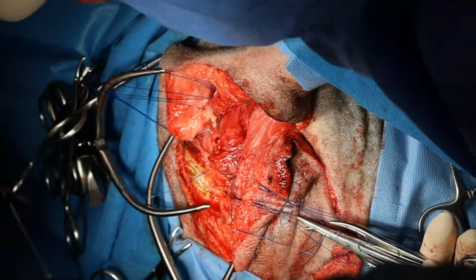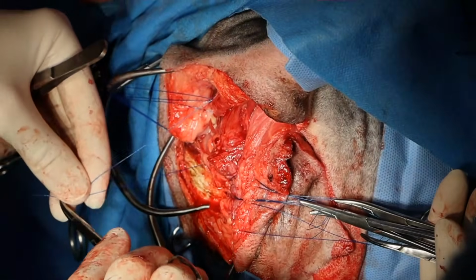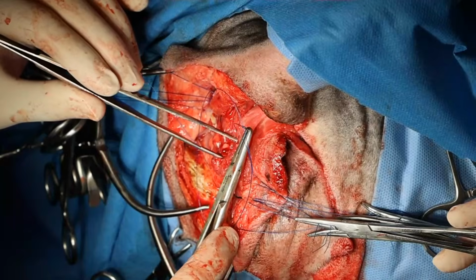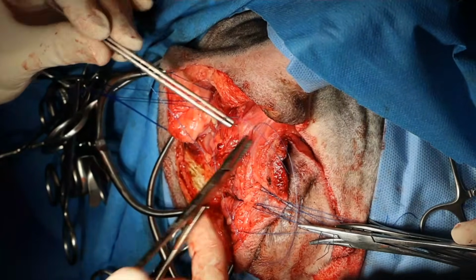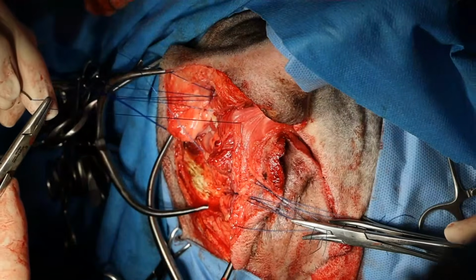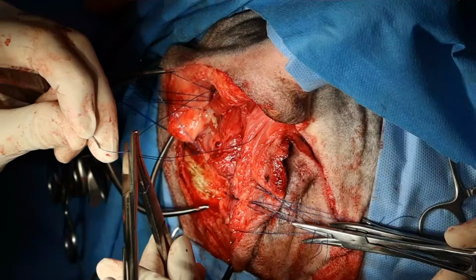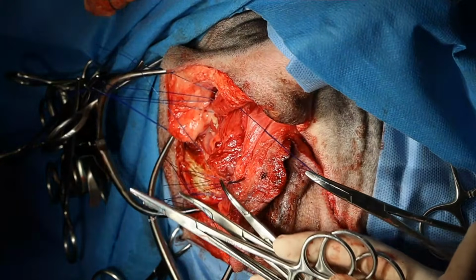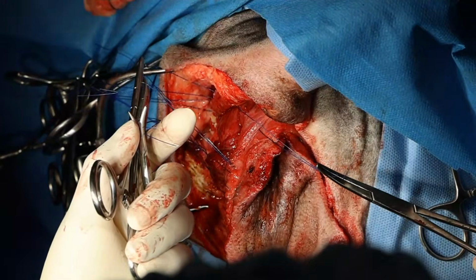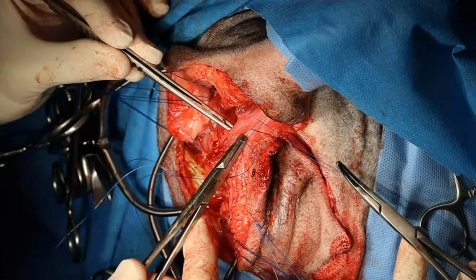And now I'll come across and do my levator ani. Sorry, internal obturator, no, guess again. Coccygeus to external anal sphincter. So that's anal sphincter there, and that's coccygeus there. It's very handy that this is a nice big skinny dog, making everything look very easy. Oh, it's hard to tell. More Prolene, please. I've got one more here. Never mind, I don't think I'll need it. All good. Thanks.